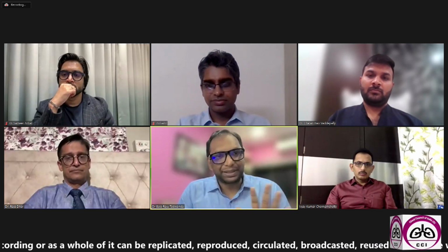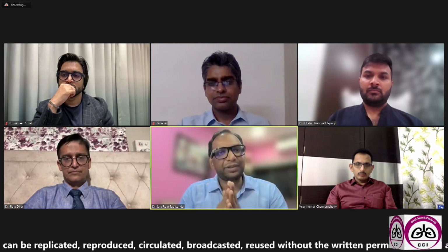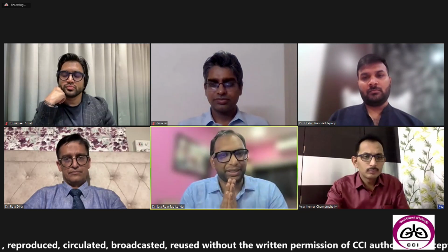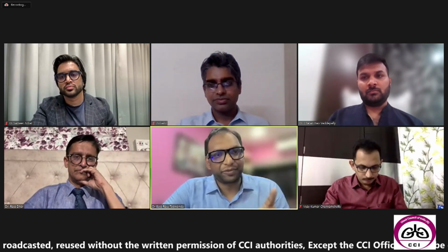This is my personal experience, especially for obese patients and short-neck ladies. It was very, very difficult to place the rigid bronchoscope inside the trachea. This was a challenge I faced. Initially, my first case of cryo was without a balloon. Luckily, it didn't bleed, so I learned my lesson. This was in 2015 when I bought the system for the first time. After that, all the cases were under a balloon.